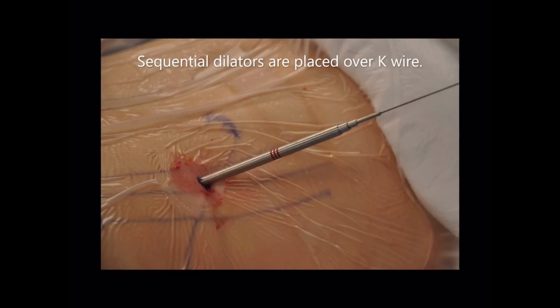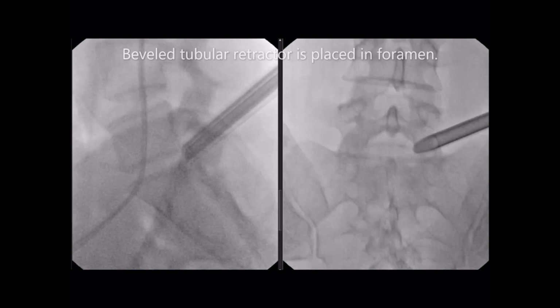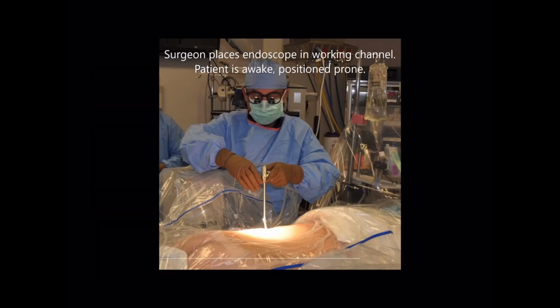With the K-wire in place, a series of dilators are inserted, followed by a series of sequential reamer drills. This is used to remove the ventral portion of the SAP. Next, we insert the beveled tubular retractor over the dilators to confirm placement with AP and lateral radiograph. At this point, we are able to insert the working channel endoscope and begin removing the disc herniation.